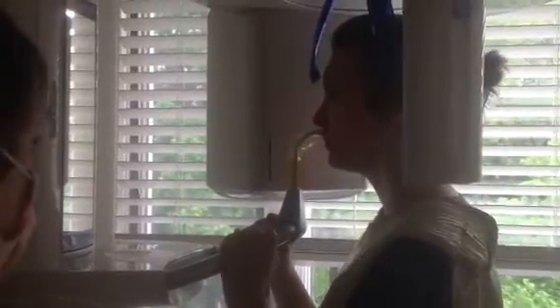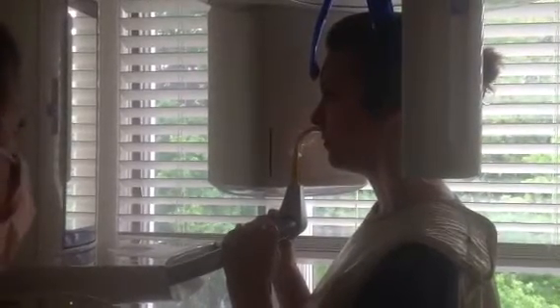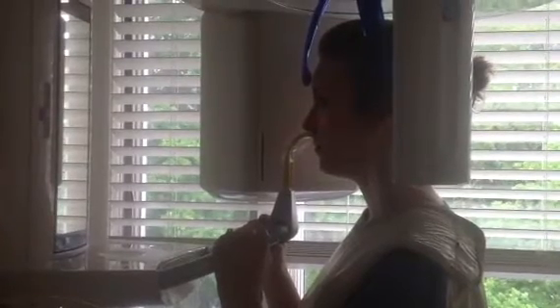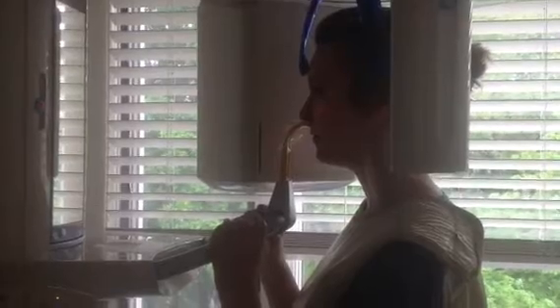We then place our patient inside, have her hold on to both handles, and rest her nose on the yellow stick. We tighten up the blue headrest to make sure the patient's head stays nice and still during the x-ray, because that's very important.